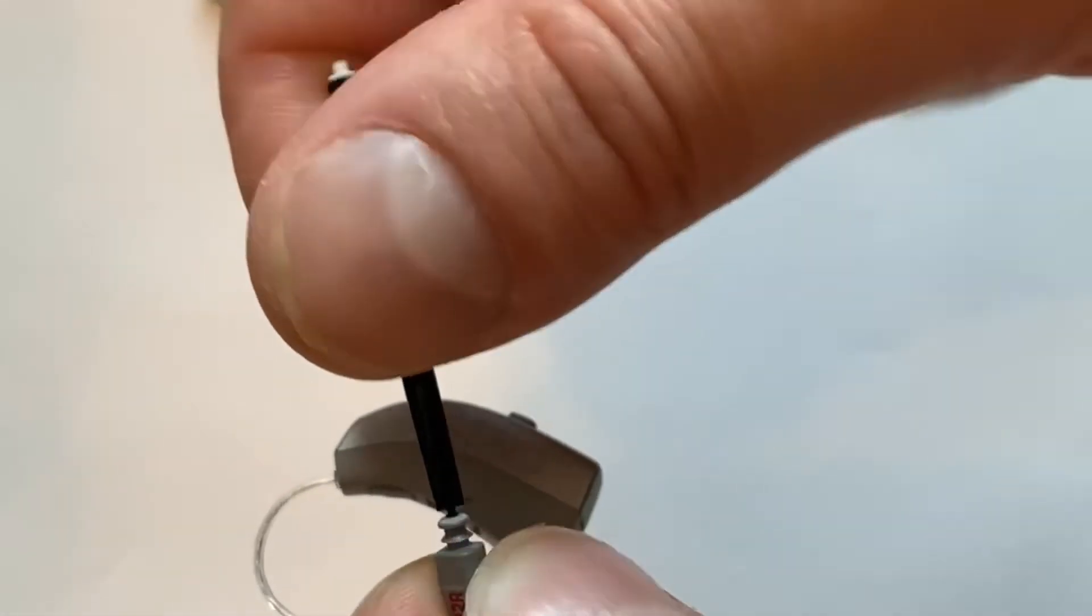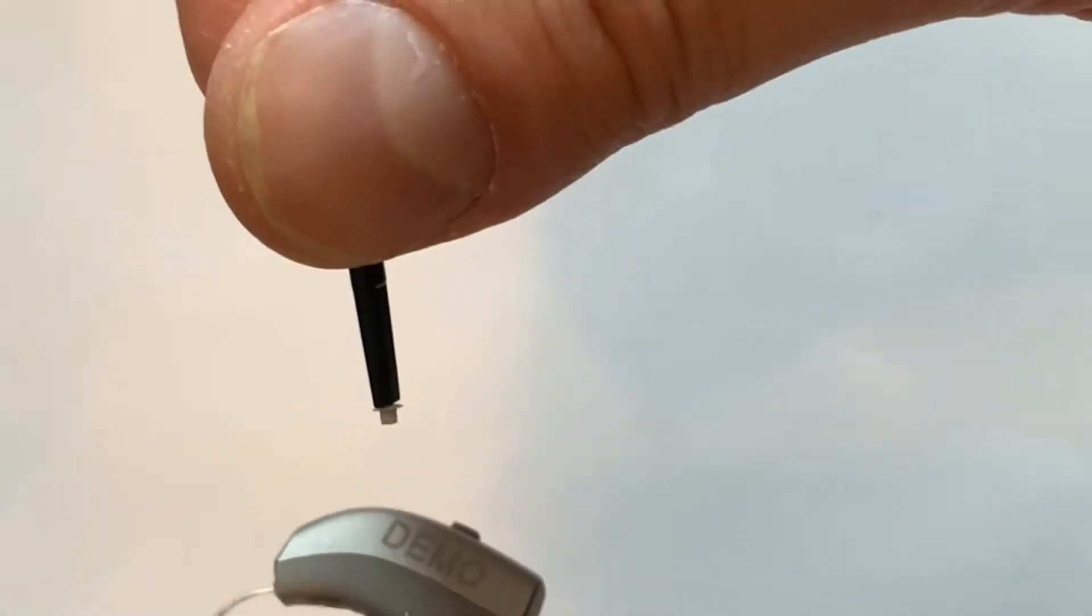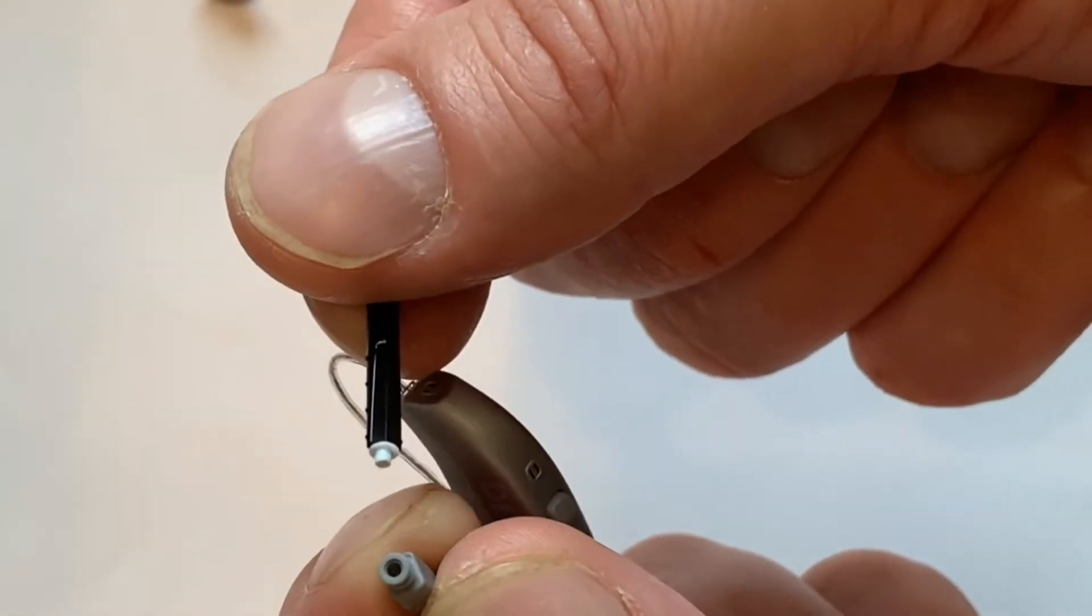It's important. You do not want to pry. You want to go straight in. It sort of clicks into position, then pull straight out. And you can see now that I've removed the old wax guard.